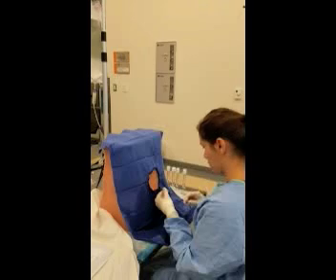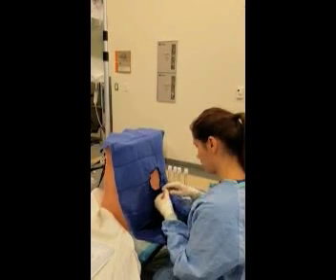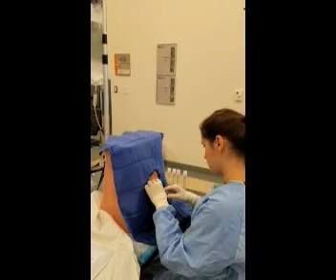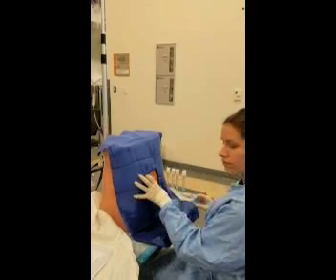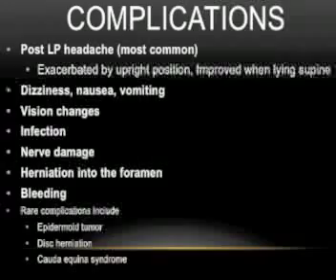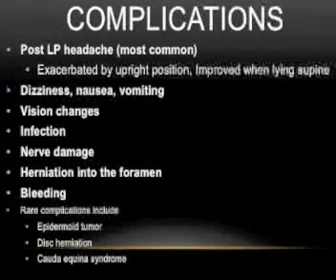Carefully remove the needle with a quick controlled motion. Apply sterile gauze and hold pressure for several minutes. Then clean the area once more with skin cleansing solution, and apply a bandage.